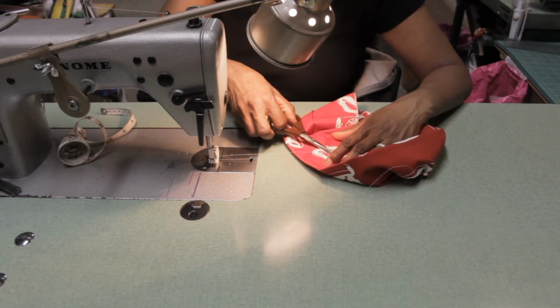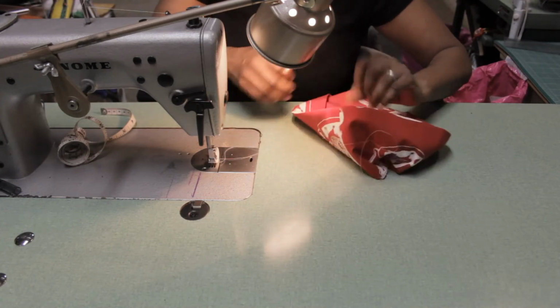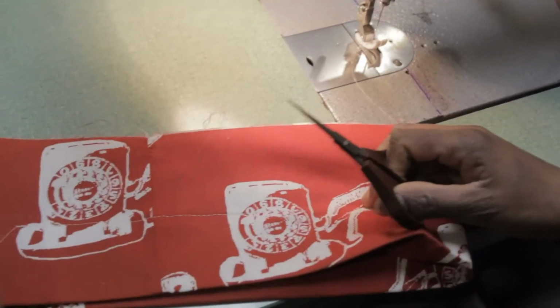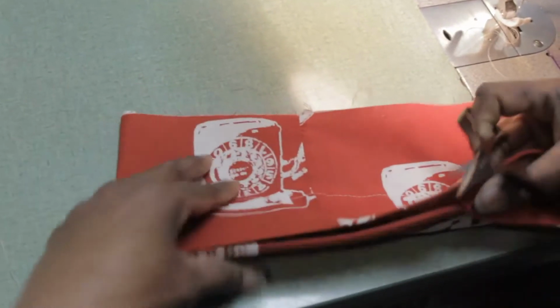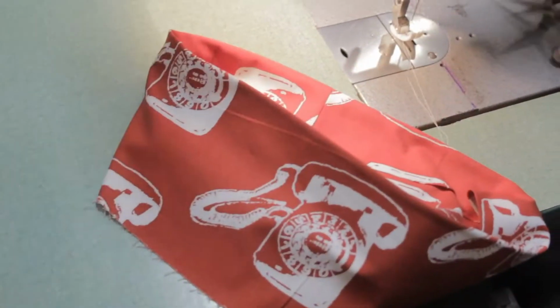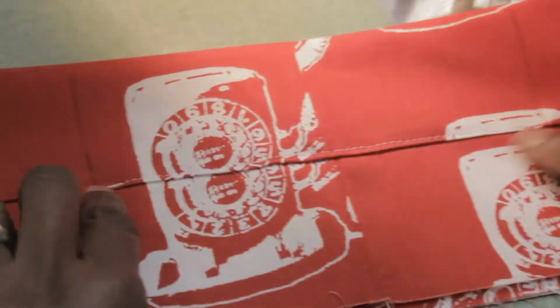And we clip our threads again. I always like to clip our threads as we go. It makes life easier. So now you've got the stitching from line to line, and you have a bit of a channel here, which is what we're going to do with the elastic.